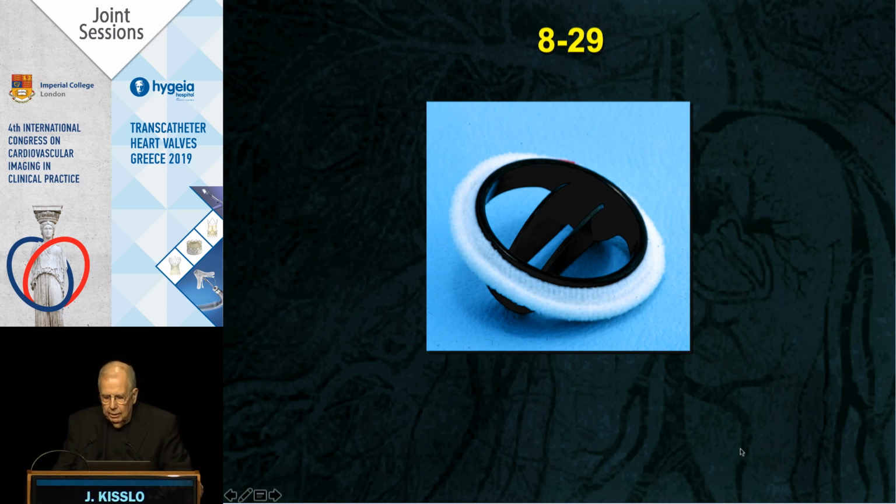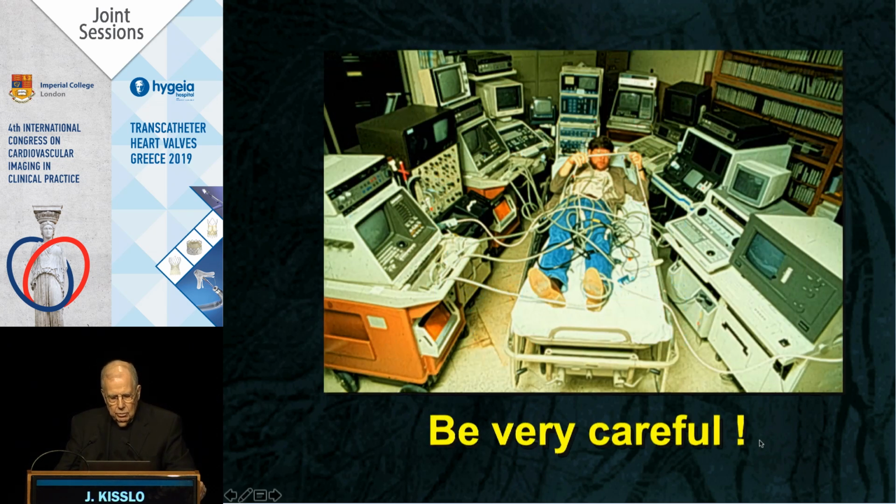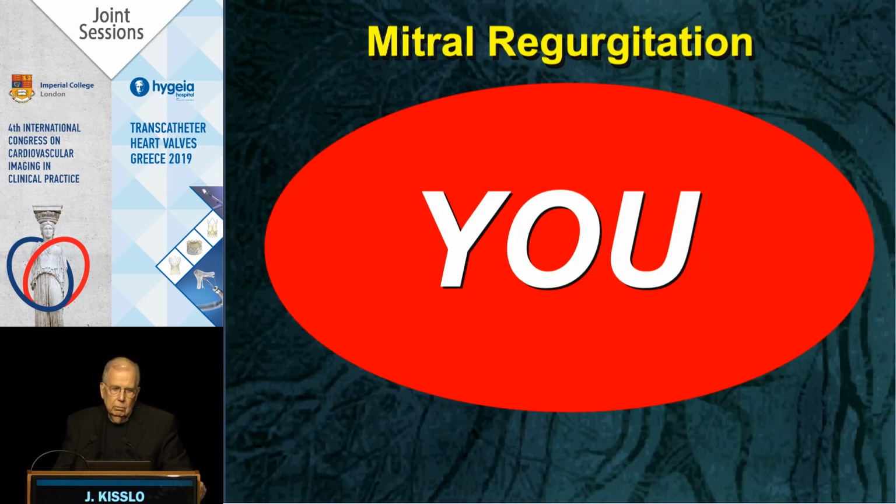So an old slide. We got all these machines, all of them behave differently. We've got different operators. We've got different standards in different labs, and a lot of us don't look at the quality or the controls of how these jets were generated. So in this old slide, just be very careful. And in conclusion, I'd just like to say the responsibility for doing it right falls to you, which means it falls to me too. I appreciate all your attention. Thank you very much.